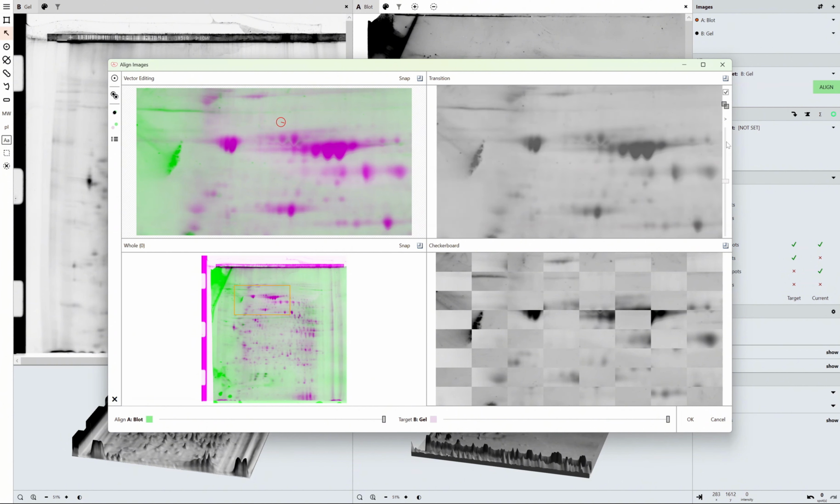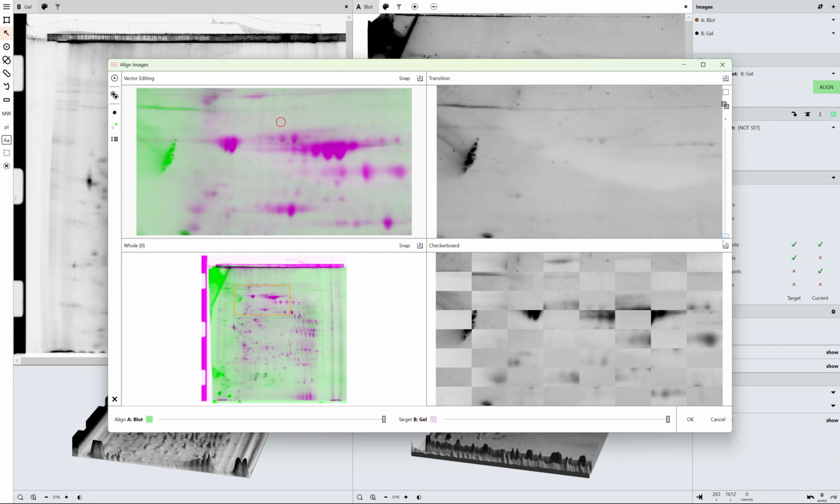So if I just turn this pause off here, you can see as we fade out, we see this section here. And we just update the alignment there. Now we can see they're flashing in place.